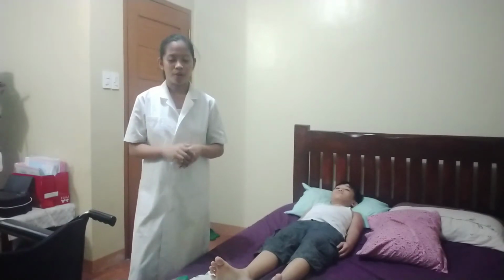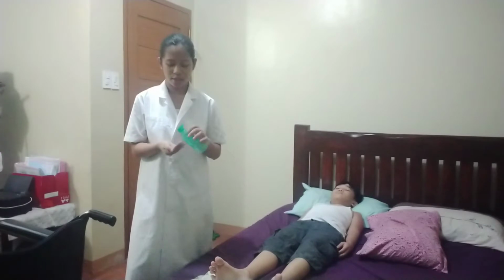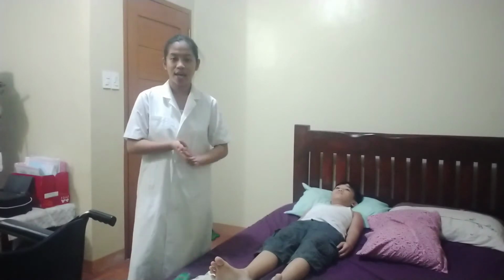And then I will perform hand hygiene and put on PPE if it is necessary or indicated. And then I will introduce myself to the patient, verify my patient's identity, and explain the procedure to the patient.